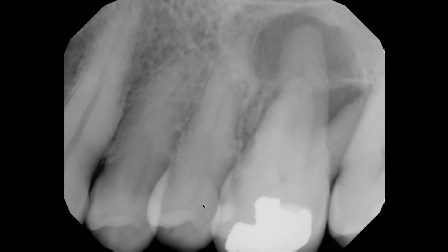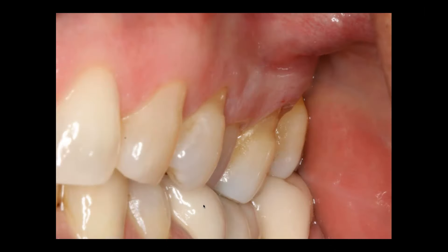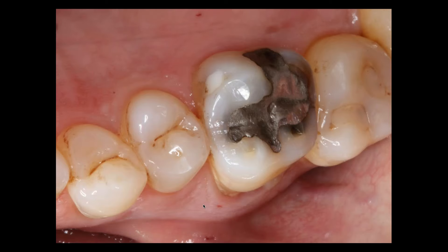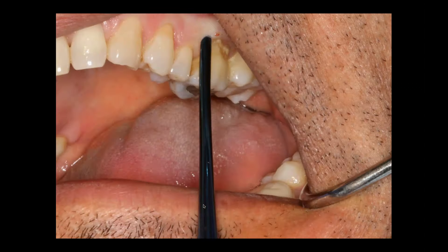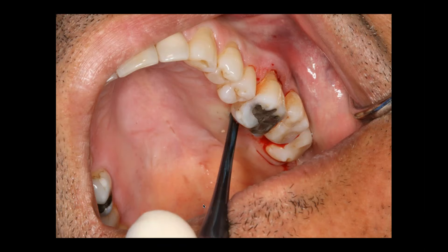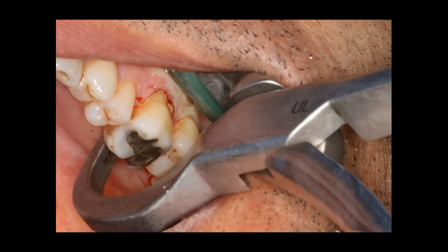So let's look at a case, an osteogen plug. We have a tooth that's deemed non-restorable, a molar tooth that we're going to take out. I take my peritome from Golden Dent and I'm simply going around the tooth structure, facial and palatal, and I'm going to take my physics forcep. You can see how I engage it. The beak is placed on the palatal surface, one to three millimeter subgingival.